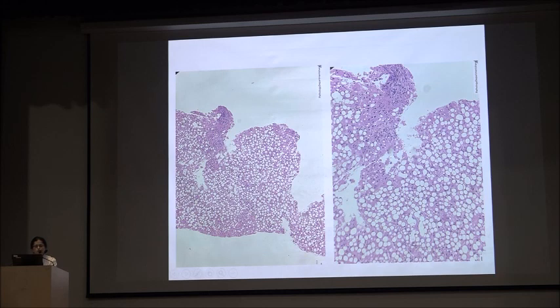Now, a high power view of this same biopsy: hardly any ballooning present over here. It is just the steatosis, very minimal portal inflammation. This is a crushed portal tract at the edge, and very negligible lobular inflammation. Just to remind you, despite so much steatosis, the biopsy can be very pauci-inflammatory and pauci-ballooning in look.